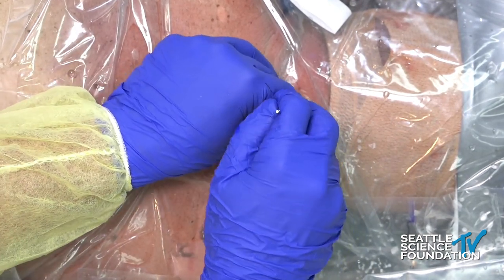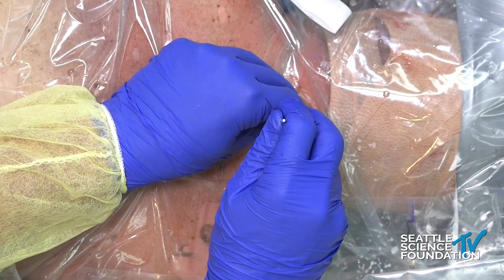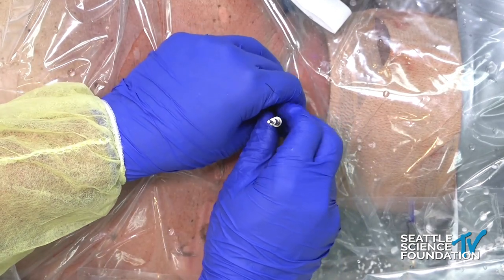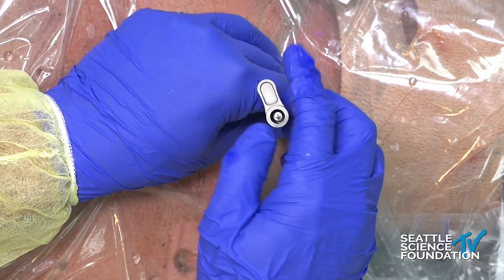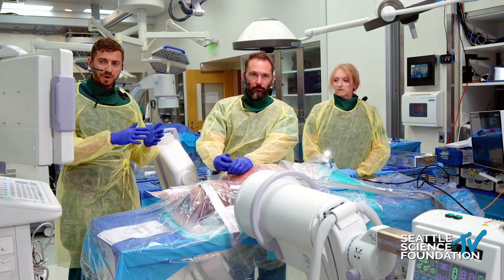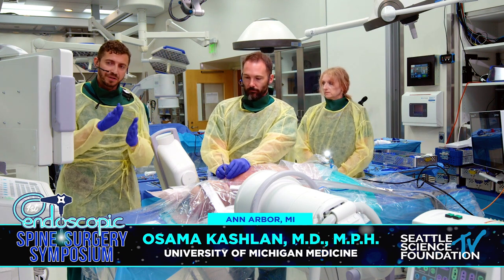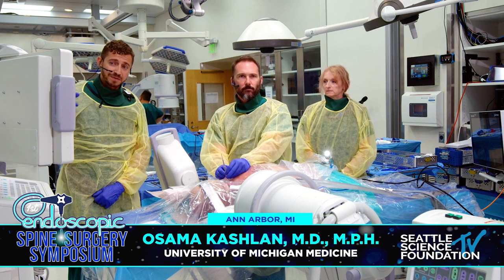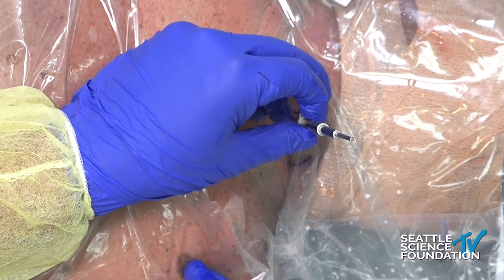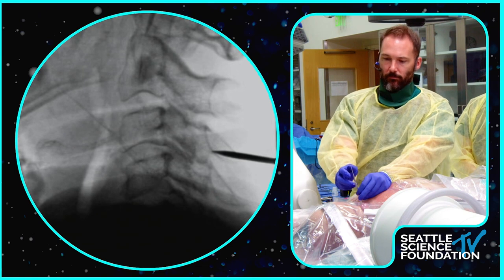With my initial dilator in there, I feel I'm on bone, scraping and where I want to be — I can make out the topographic landmarks. Now using dilators, same as an interlaminar approach. Different surgeons approach the disc space using different angles. Some like to start lower and aim up, parallel to the interspinous space, which minimizes bone removal. Dr. McGrath starts lower going higher. But some prefer a more straight-on approach — Dr. Derman, who you'll hear from later, does that. There are benefits to either approach and we'll discuss those later.